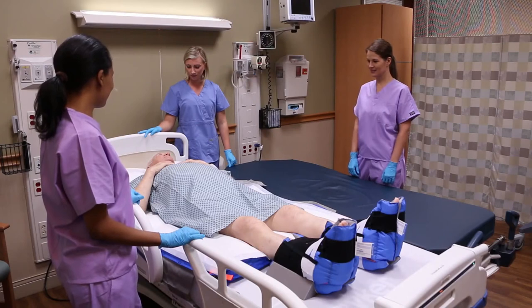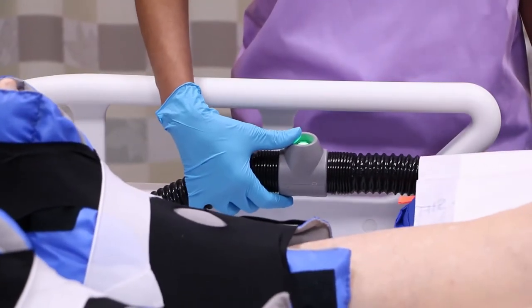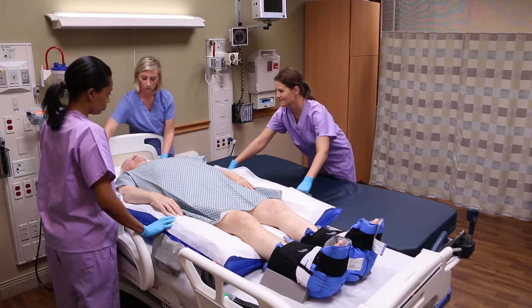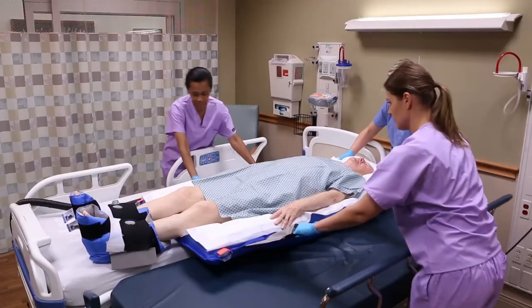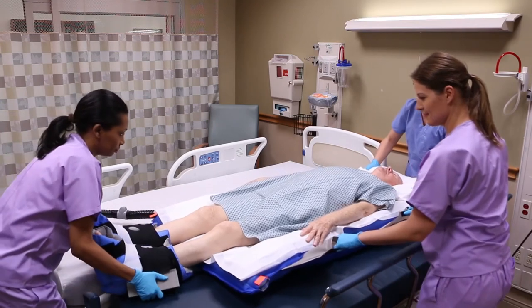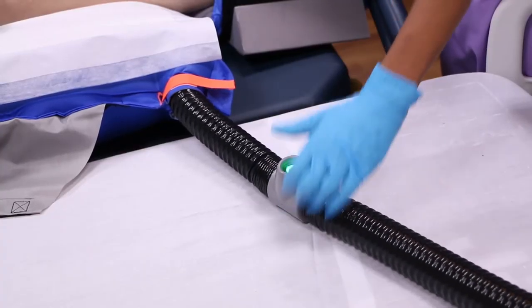With a caregiver on each side of the support surfaces, turn the booster pump on. When the glide sheet is fully inflated, the caregiver closest to the patient gently glides the patient to the receiving surface. The receiving caregiver should grasp the handles and glide the patient into position.